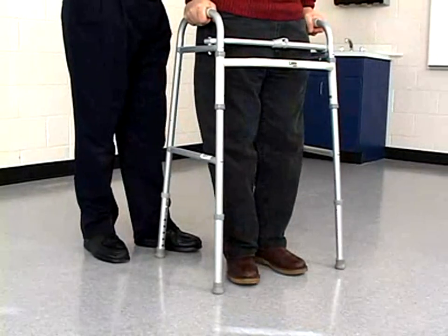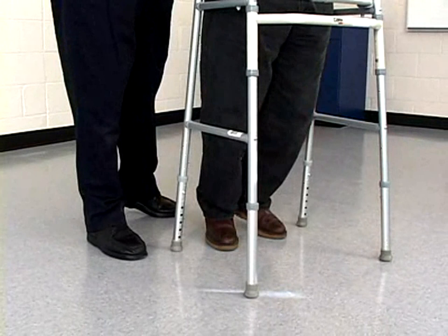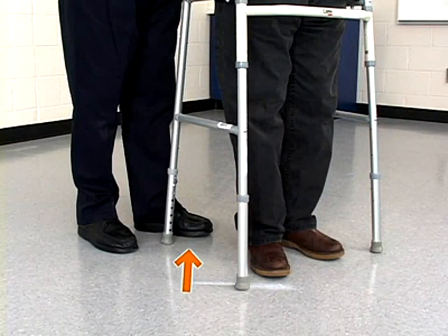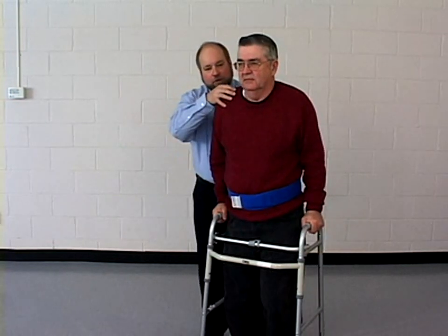The patient can then let his body swing forward into the walker. The therapist moves his left or inside foot as the patient swings forward. The patient lowers himself at the end of the swing and bears weight on his lower extremities.